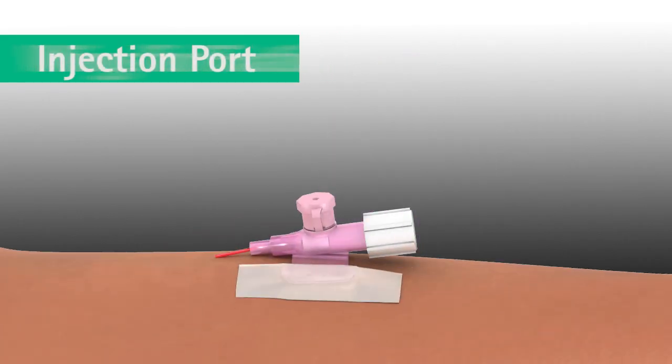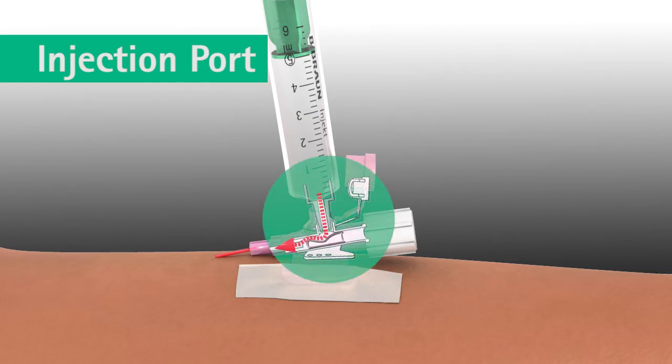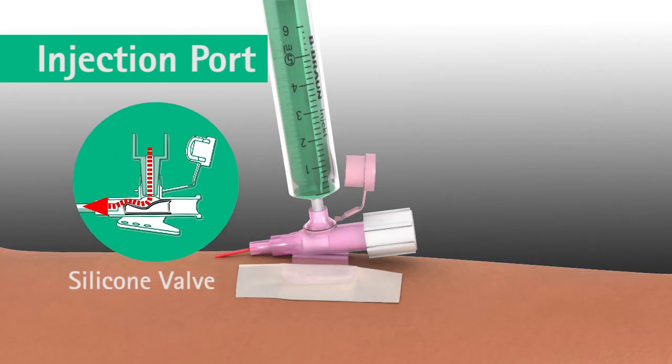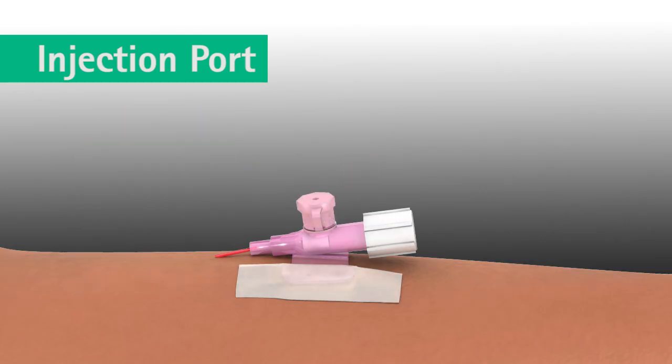The integrated injection port on the catheter hub of the Varsafix safety IV catheter offers hygienic needle-free injection of medication, eliminating any risk of a needle stick injury. To inject medication, attach a syringe with a slight twisting movement. The integrated injection port contains a valve which opens and closes automatically and prevents back flow of liquids. It is possible to lock the injection port by turning the protective cap 180 degrees.